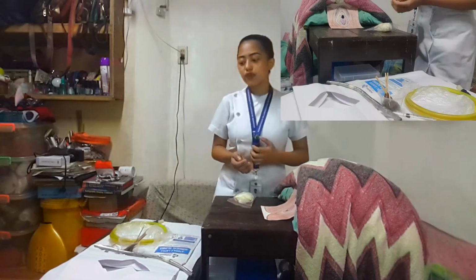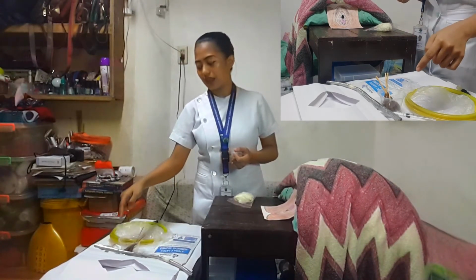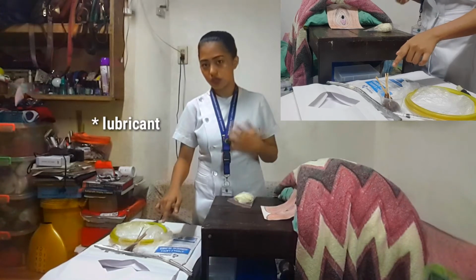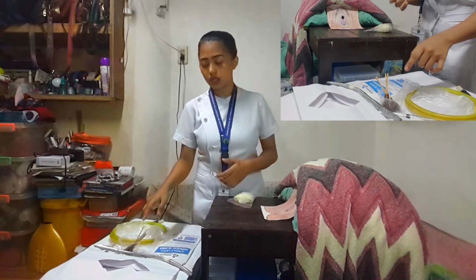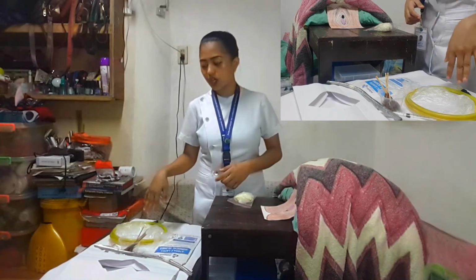After that, we will proceed to preparing the equipment that we will be using. For this procedure, we'll be using a fenestrated drape, of course the indwelling catheter, the sterile syringe with saline, lubrication, betadine together with cotton applicators, the sterile gloves, of course the collection system, the drainage bag.